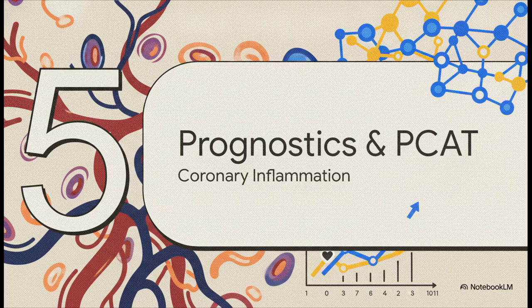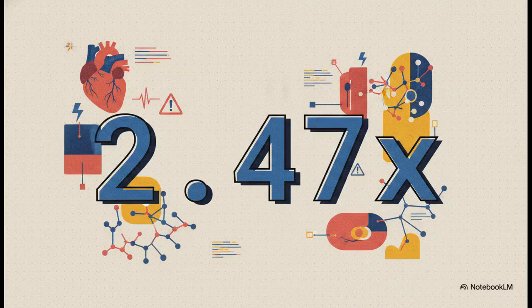Section 5. Prognostics and PCAT. Let's talk about measuring coronary inflammation. Now, how do these AI models actually help us predict outcomes years down the line? I want you to consider this vital number on the screen, 2.47. In a truly fascinating study of 768 patients with obstructive CAD, researchers paired the AI-QCT ischemia algorithm we discussed earlier with downstream 15O water PET perfusion scans. They were looking for incremental value. What they found was profound.